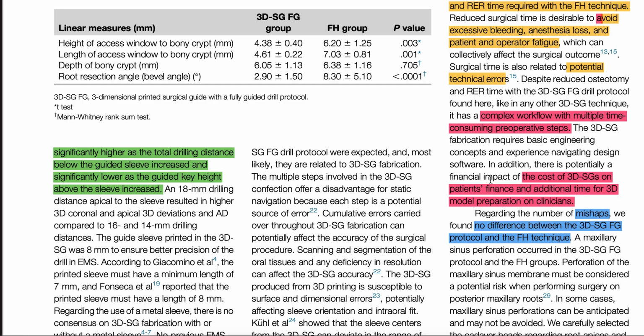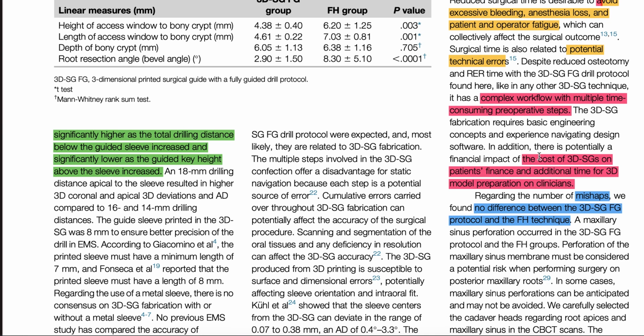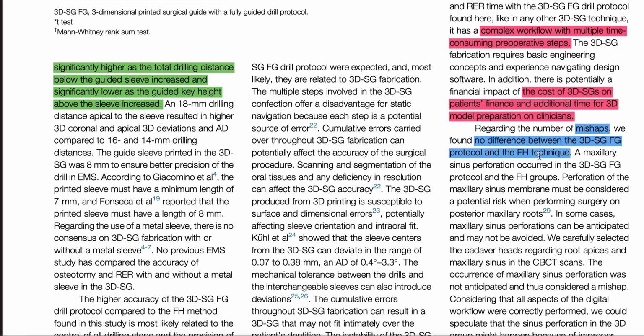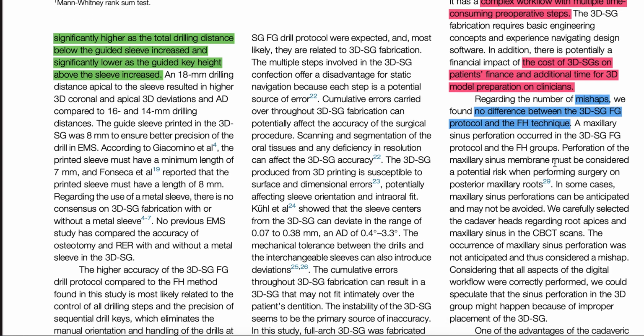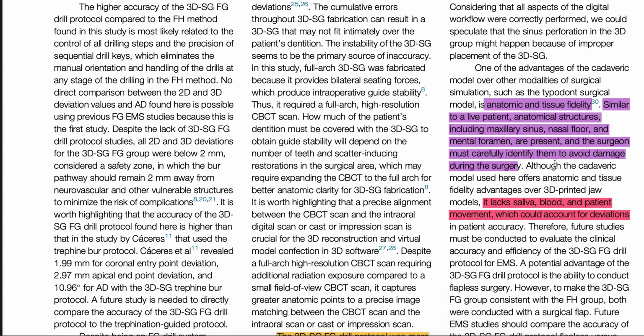However, this guided technique has disadvantages of complex workflow, multiple time-consuming preoperative steps, and also the cost to the patient's finances and additional time for 3D model preparation for clinicians. However, regarding the number of mishaps, there was no significant difference between the 2 groups.